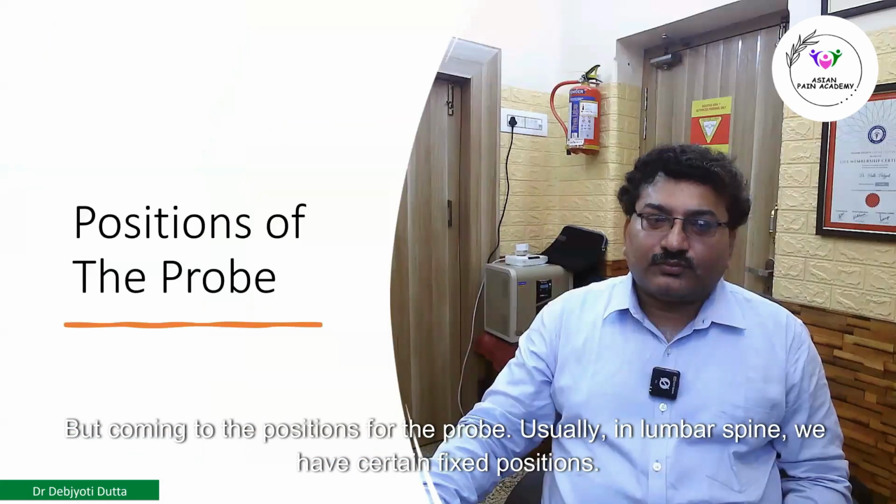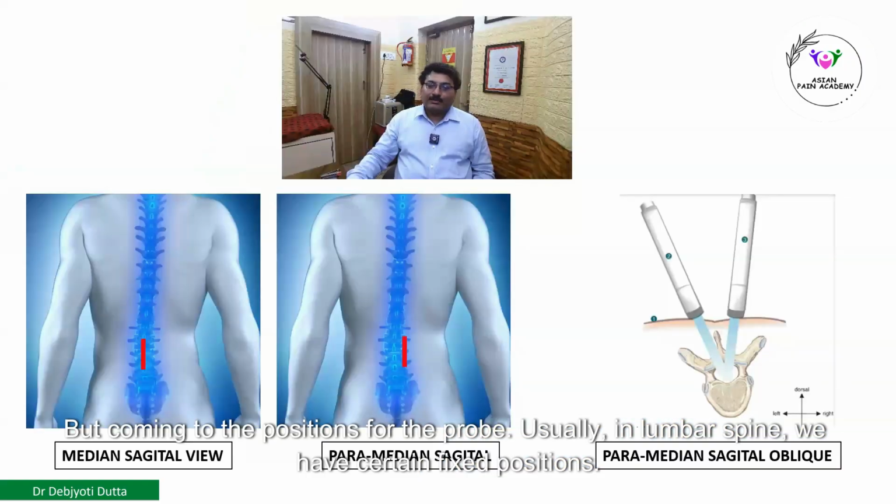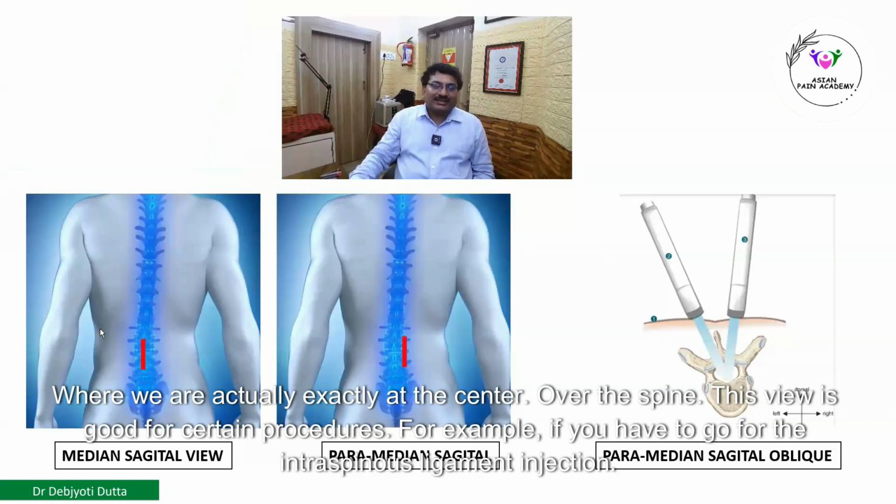Now coming to the positions for the probe. Usually in the lumbar spine, we have certain fixed positions by which we evaluate the lumbar spine. From the center, it is the median sagittal view, where we are exactly at the center over the spine. This view is good for certain procedures. For example, if you have to go for the interspinous ligament injection, we can go for this view.